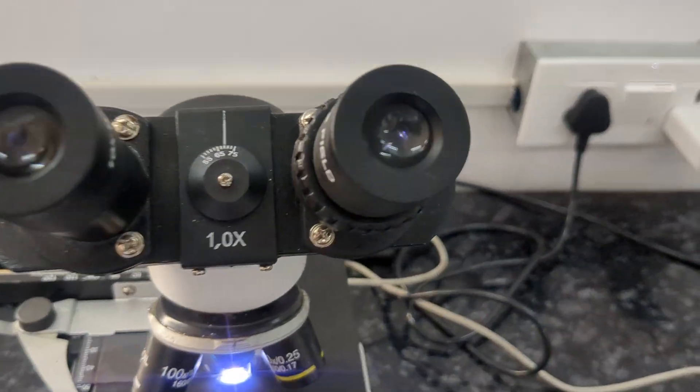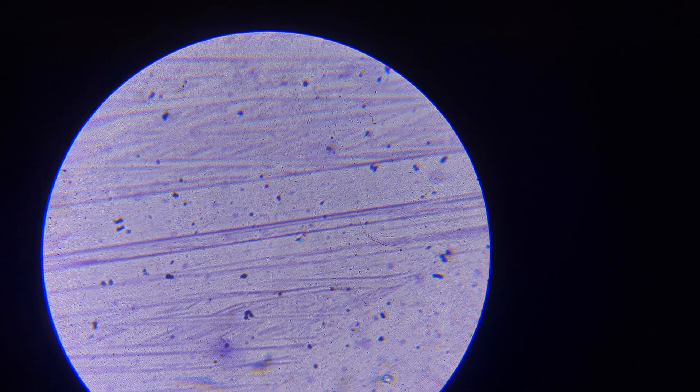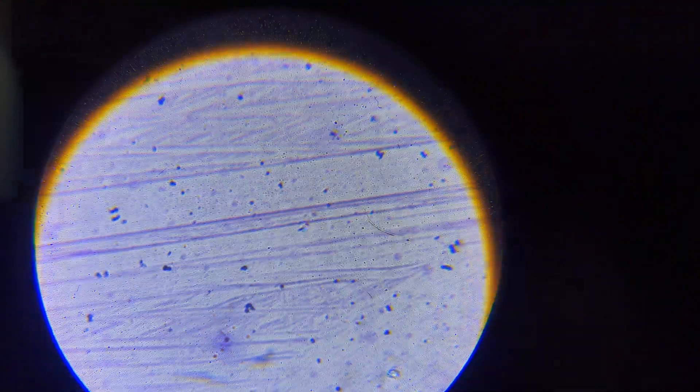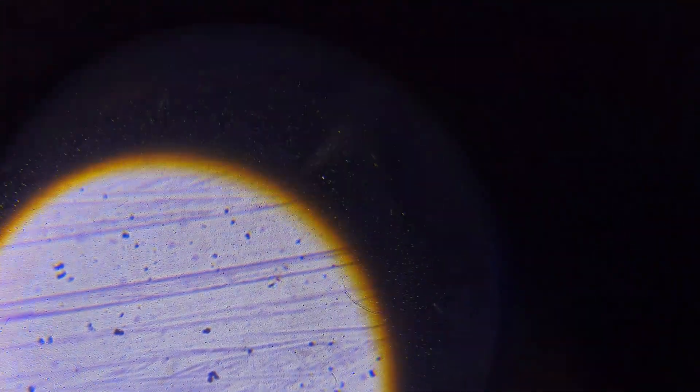The microscopy has been performed. Let us see the neutrophil — it is at the center. Can you see a cell here? That is a neutrophil. It is very tough to focus, but you can see a clear neutrophil at the bottom at the six o'clock position.